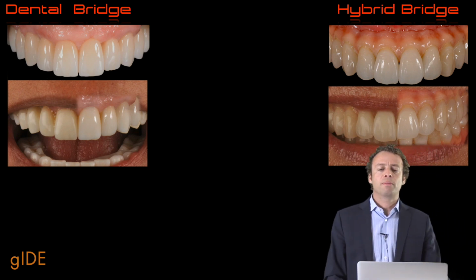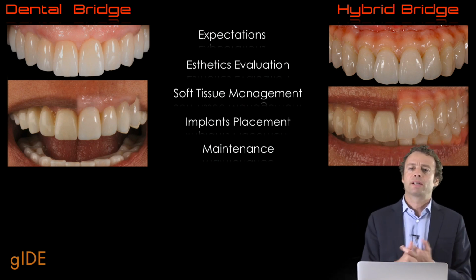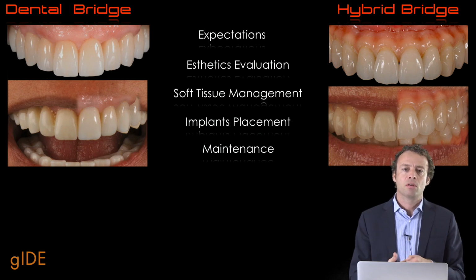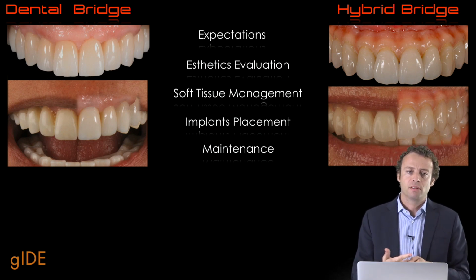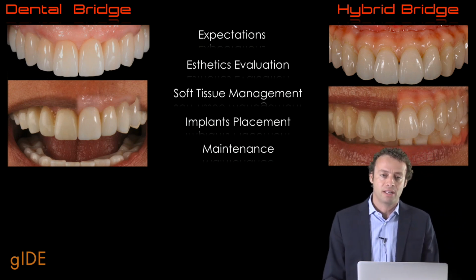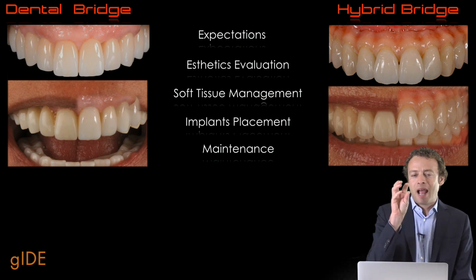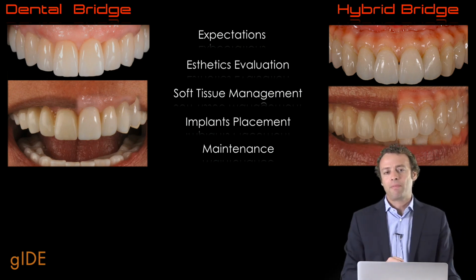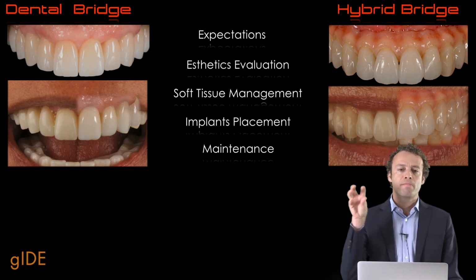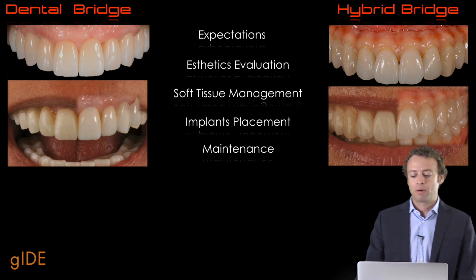And of course, the treatment plans of these two different approaches are completely different in terms of the expectations of the patients, in terms of the aesthetic evaluation, the soft tissue management, the implant placement, and of course also the maintenance. So it's really important to be able to evaluate this kind of aspect at the beginning of the therapy. Before starting the therapy, before starting the implant placement, it is really important to understand in which kind of situation we are with our patients.